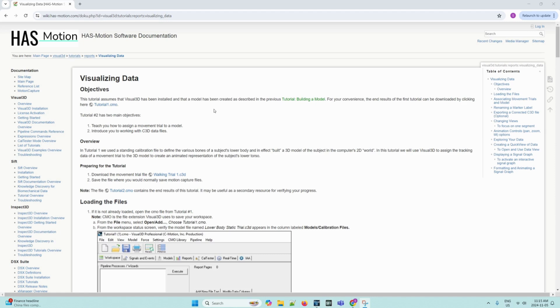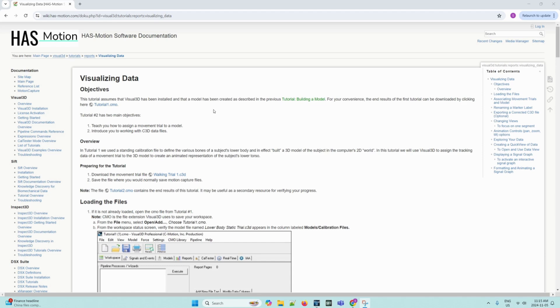In the first tutorial, we used a standing calibration file to define the various bones of a subject's lower body and in effect built a 3D model of the subject. In this tutorial, we will use Visual 3D to assign the tracking data of a movement trial to a 3D model to create an animated representation of the subject's lower torso.